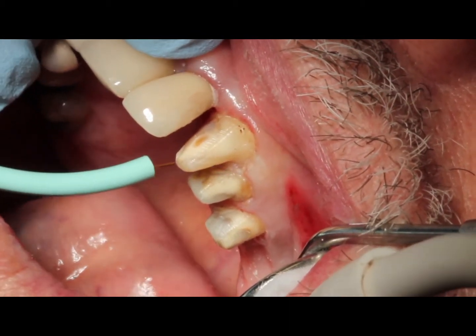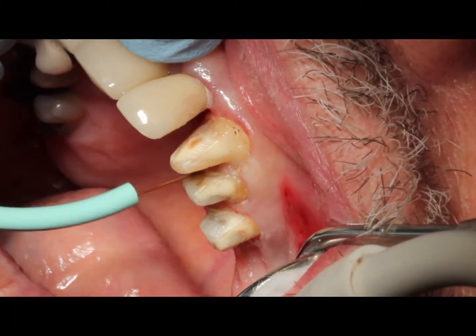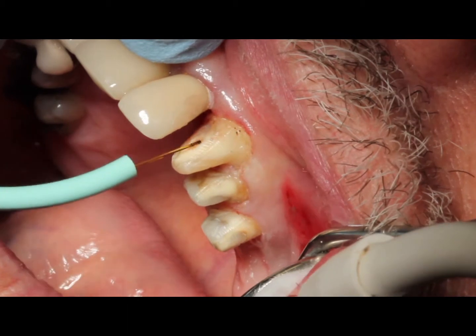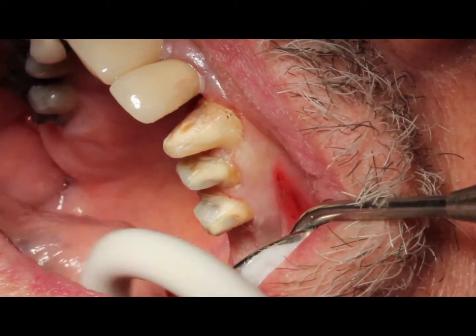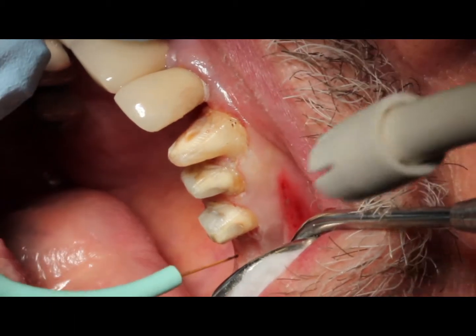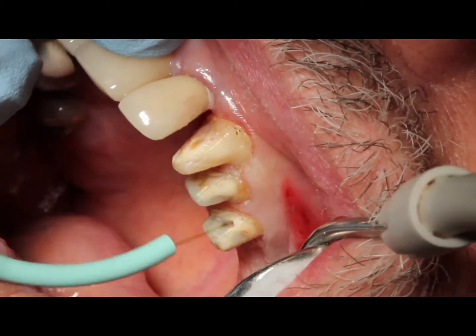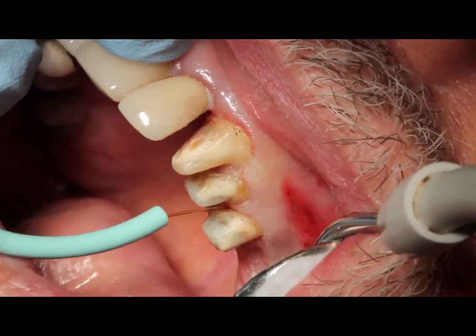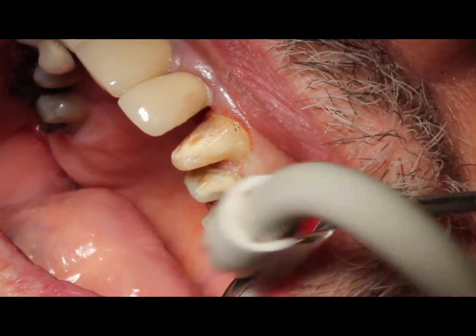We're just going to go along, and that's going to open that up just enough so we can get that impression material into the sulcus and get a great impression without having to pack cords. Now if you have a deeper pocket or a deeper margin, you might still in some instances have to place a cord, but in most instances you won't, and you should get a great result.